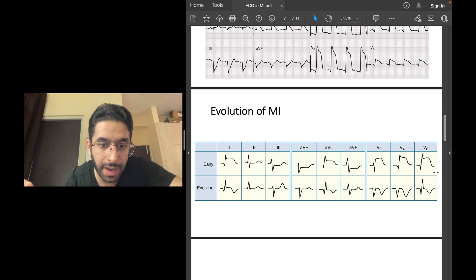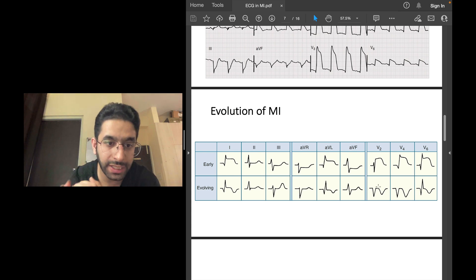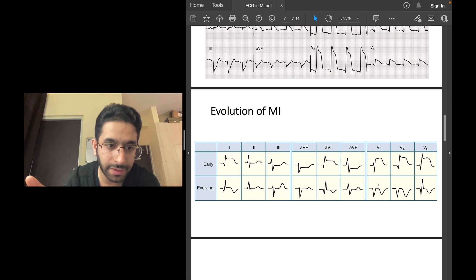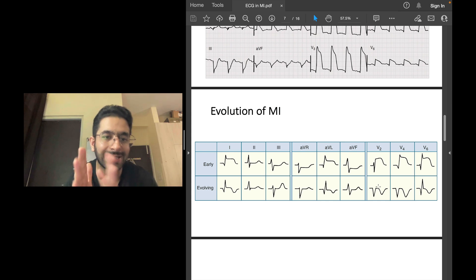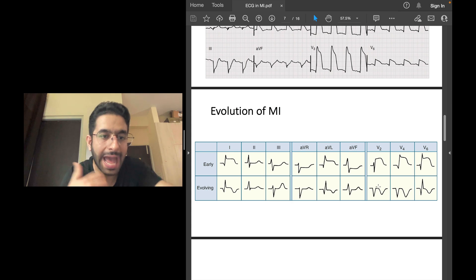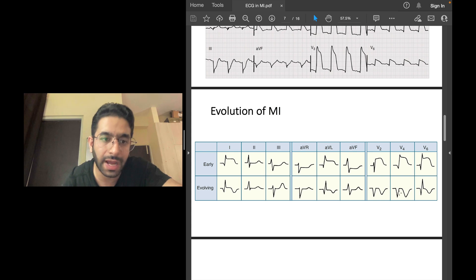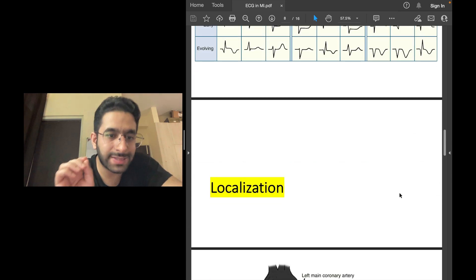This represents an evolved ST elevation MI: deep QS complexes and inverted T waves. So an STEMI starts with hyperacute T waves, then ST elevation sets in, then ST elevation begins to come down, Q waves appear, and T waves become inverted. Over subsequent hours and days, T inversion resolves, but Q waves generally persist — representing prior transmural infarction — as a marker on the ECG.